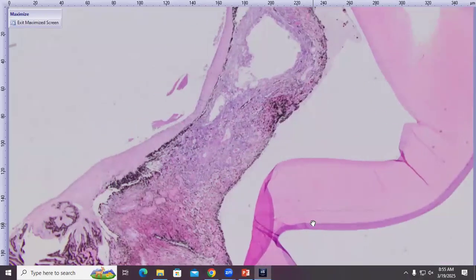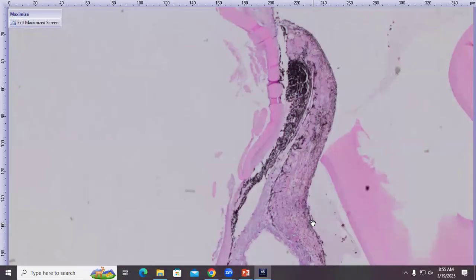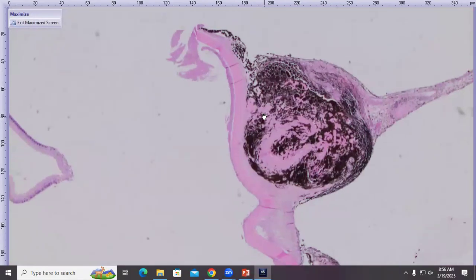So we can see that the anterior uvea is looking a little bit purple, so there's some cells there. Here's the lens capsule, and the lens capsule is still in place more or less in the posterior chamber. It's fused to the back of the iris, or the iris is fused to it, or both. It's ruptured, so we can see that the posterior lens capsule is kind of curled on itself and discontinuous.